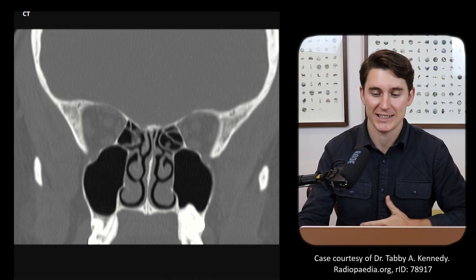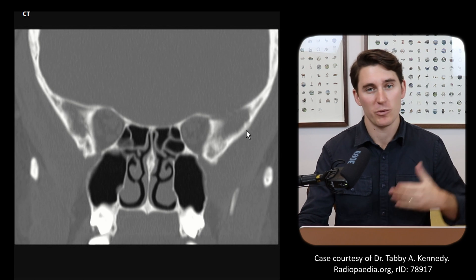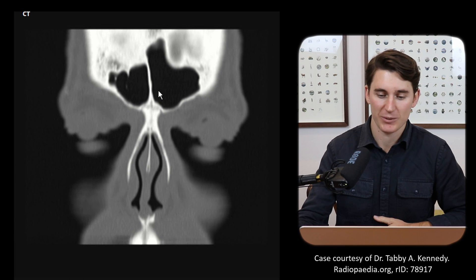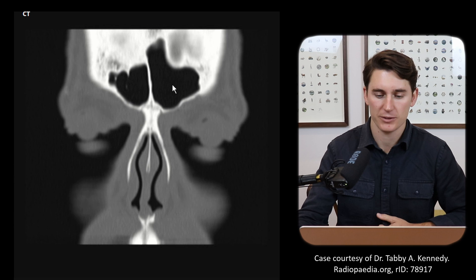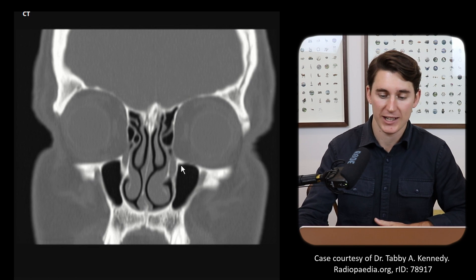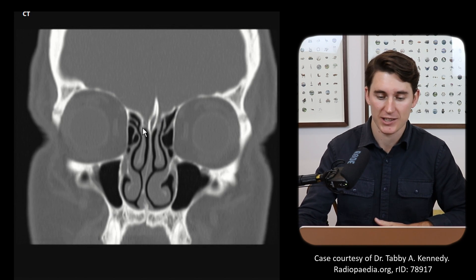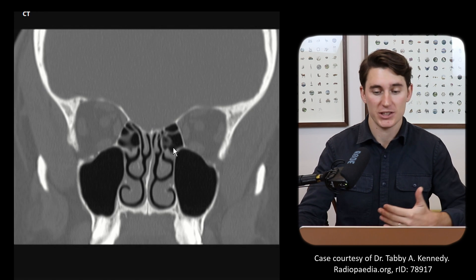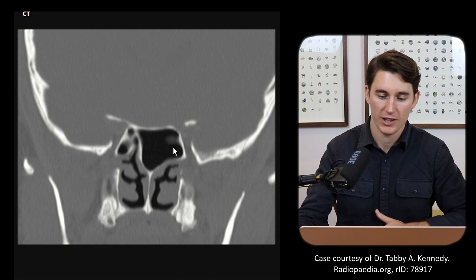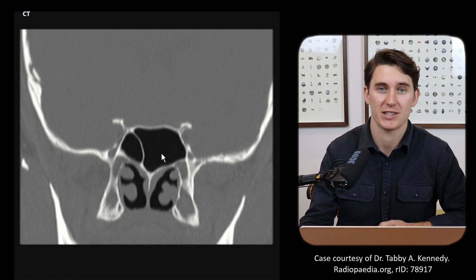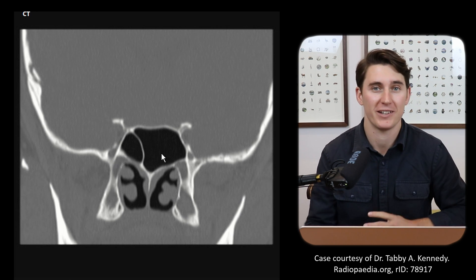Here we have a coronal plane CT, bone windowed. Coming to the most anterior portion of the scan, the first thing we notice is our frontal sinuses within the frontal bone. As we head more posteriorly, we'll see our maxillary sinuses starting to form as well as our ethmoid sinus. We can see our left and right maxillary sinuses, the ethmoid air cells heading all the way back, and then the sphenoid sinus comes into view. So we have our frontal, maxillary, ethmoidal, and sphenoid sinuses — those are the four paranasal sinuses.